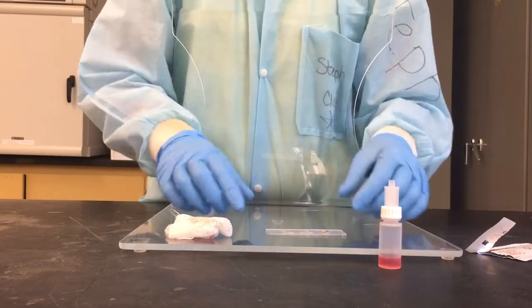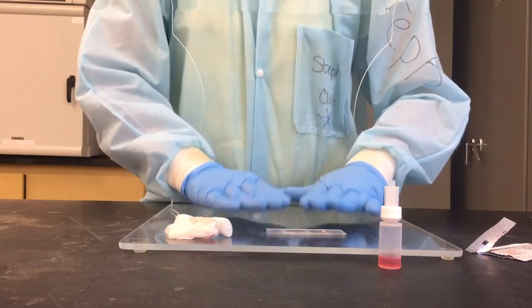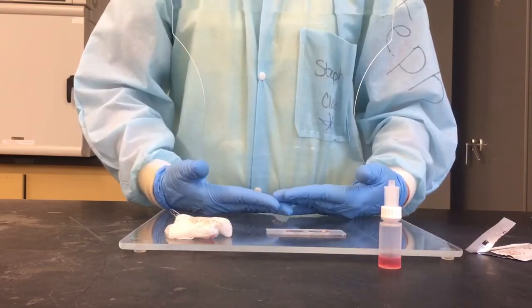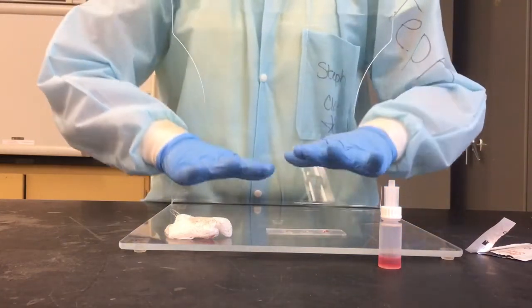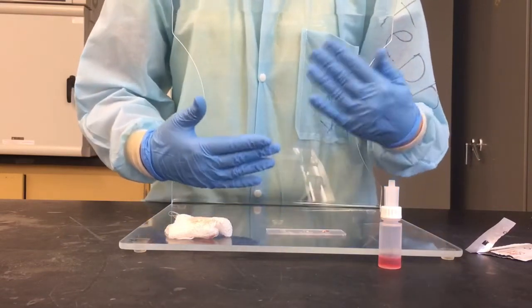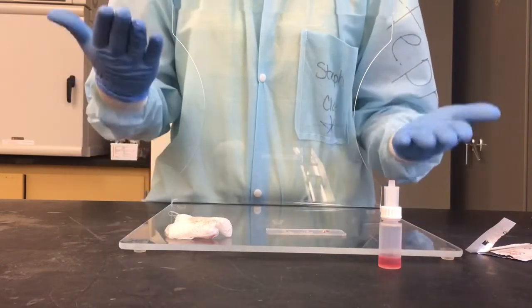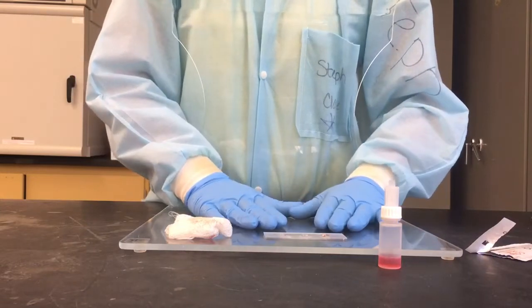So at this point, we have our hemocytometer, it's loaded, it's ready to go. We need to give it about 5 minutes or so to let all of the white blood cells settle. When you first load it, they're kind of just floating around in space, so you need to give it a few minutes for them to all settle into the same plane, so that once you have started looking at your cells, everybody's in the same field of focus and you don't have to keep going up and down all the time.